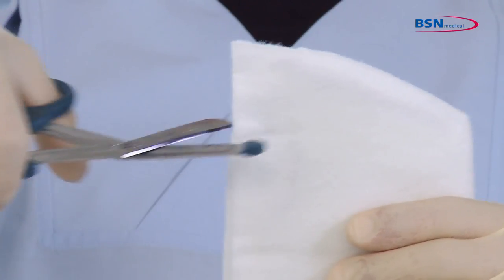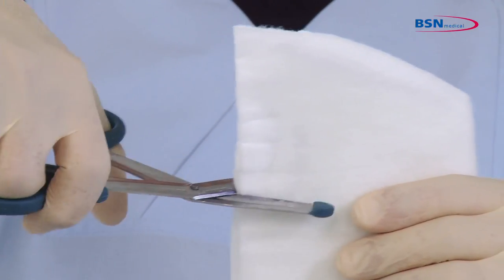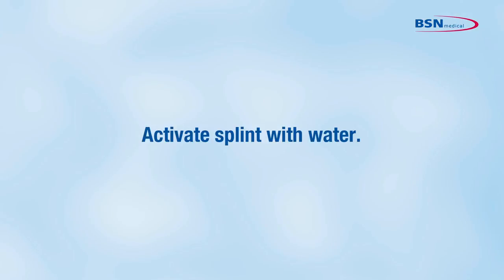If you cut a space for the thumb into the substrate, place some small cuts in the padding as well. Then activate the splint with water.